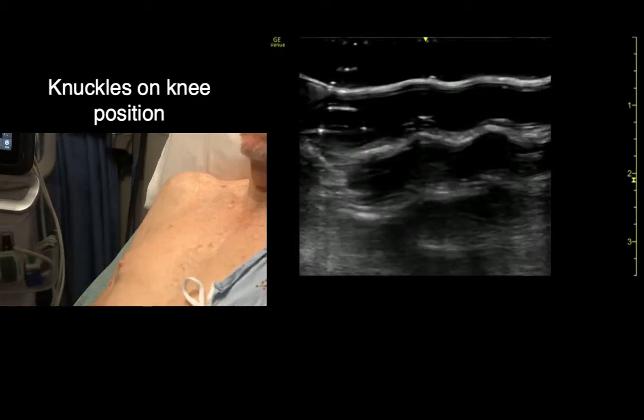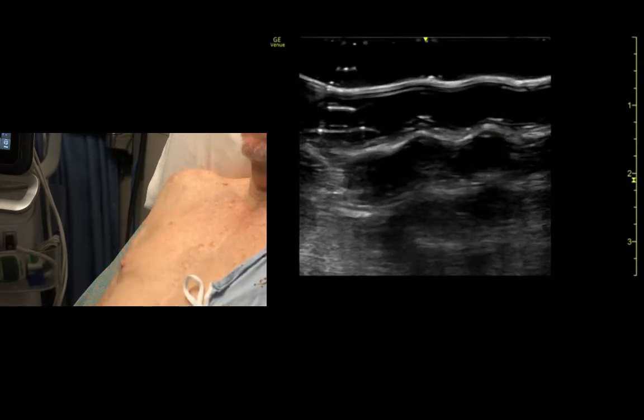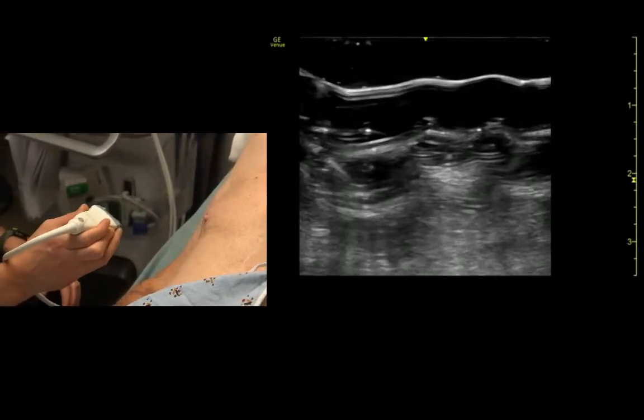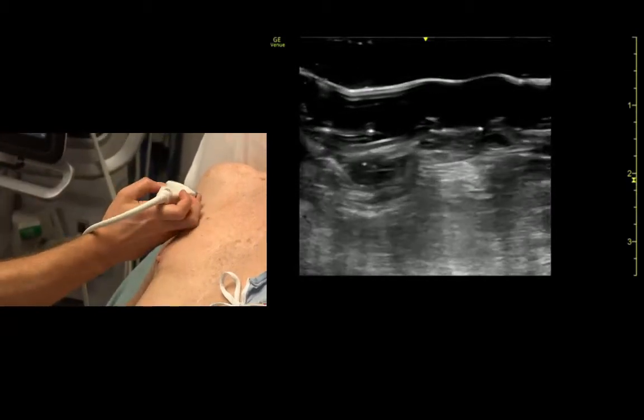We're going to start with the structures in the shoulder. For this we're going to ask Don to position on his knees and on his knuckles — the knees and knuckles position — using the linear probe. First things we're going to look for are the bicipital groove and the bicipital tendon. We have the probe with the indicator directed to the patient's right.